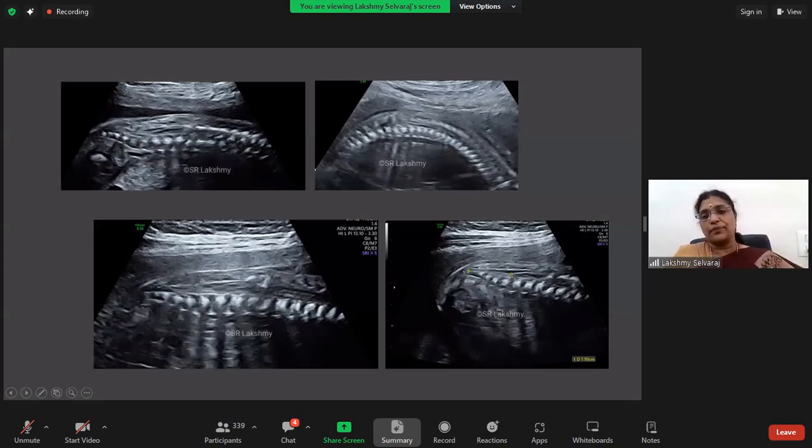But even if you do not measure, you will truly identify that this is a low-lying conus, because simply counting back from the vertebra, S4, S3, S2, S1, L5 level, you see the conus at L5 level. So that is how you can identify. I know I have a bony spur, but even before I went to the coronal view to confirm whether this is diastematomyelia, I just checked the position of the conus, because this will give me a clue whether there is an associated low-lying conus with diastematomyelia.